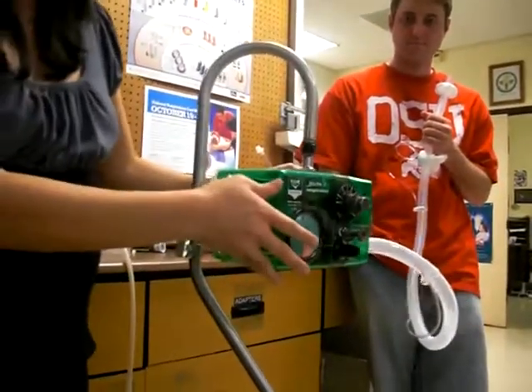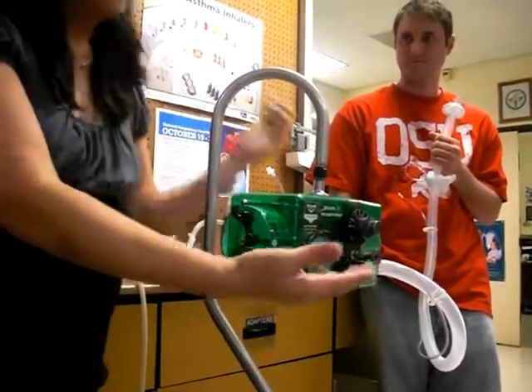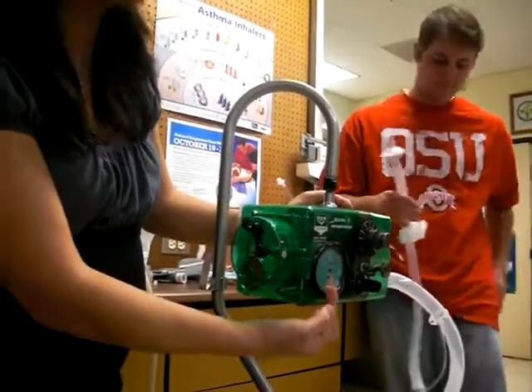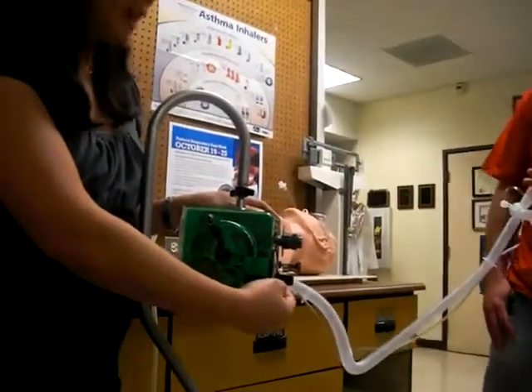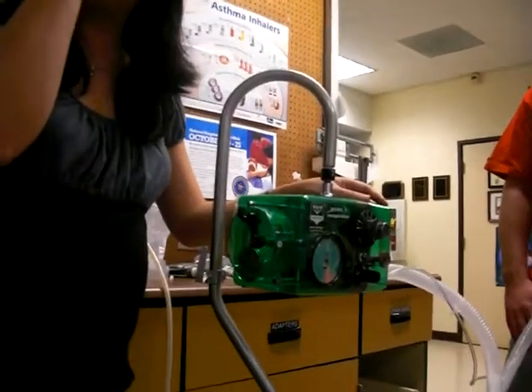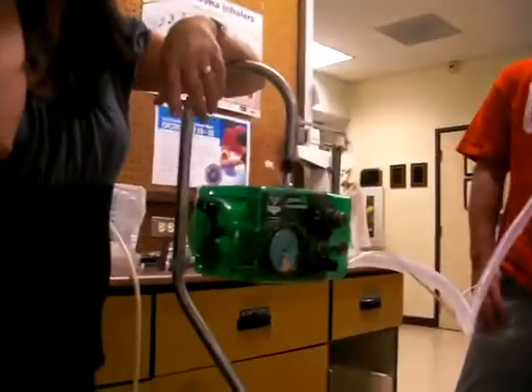So you're looking at the manometer to see what pressure you're giving. You look at the manometer to see how the needle rises — if it's too slow, too fast, or just right. And you look at the manometer to see what the sensitivity is. The sensitivity — you have to look at when he sucks in, how far back does it go. That's right at the beginning of the breath; you see this peach-colored area? That's where you look for your sensitivity. Because sensitivity is negative 1 to negative 2, meaning it's less than ambient pressure. So when Bo sucks in, you have to look where the needle goes to — negative one.